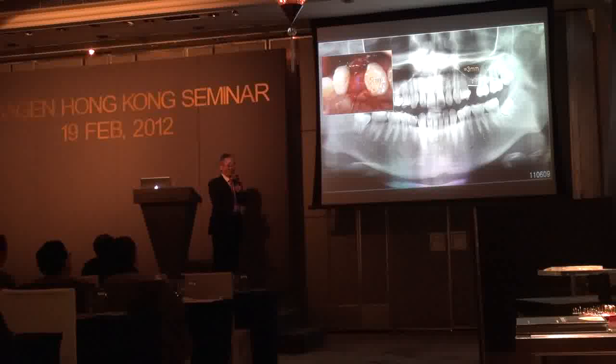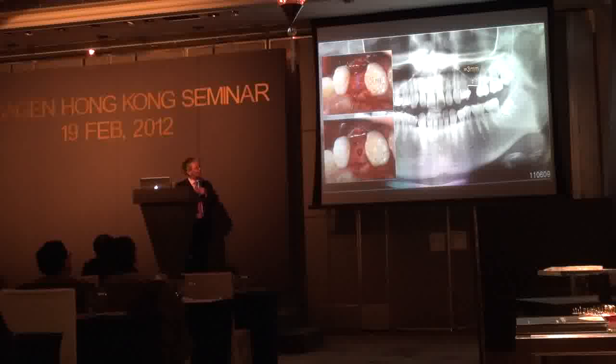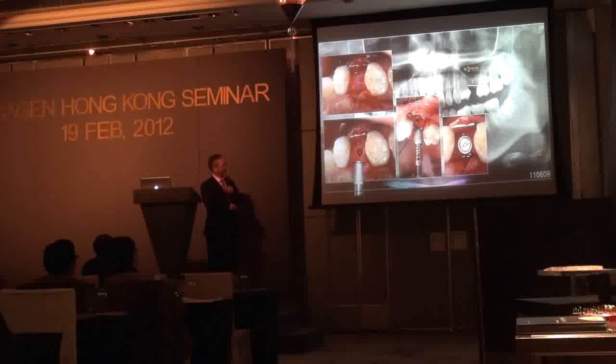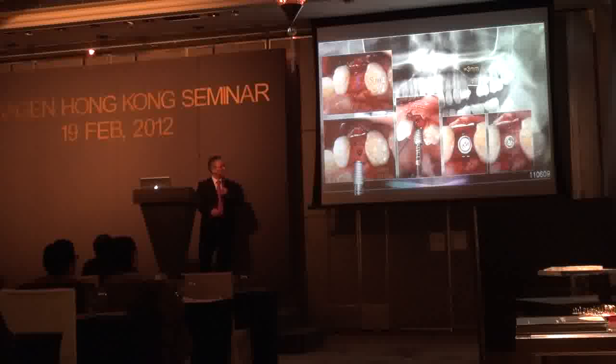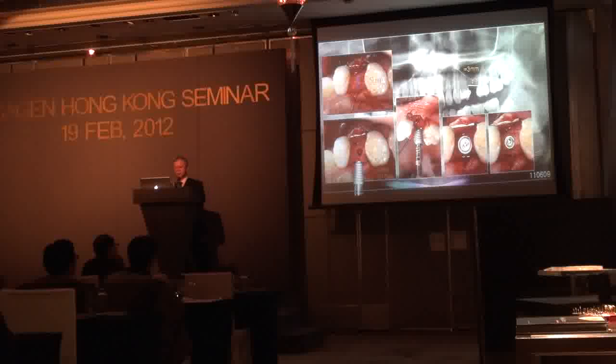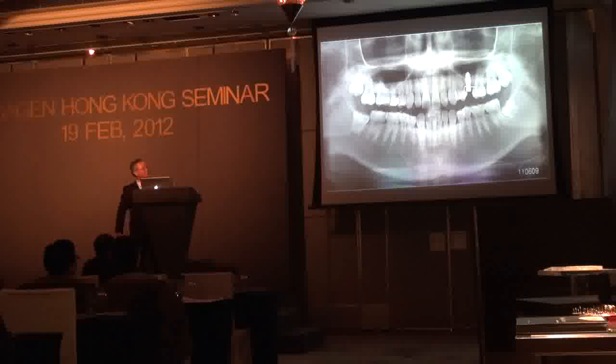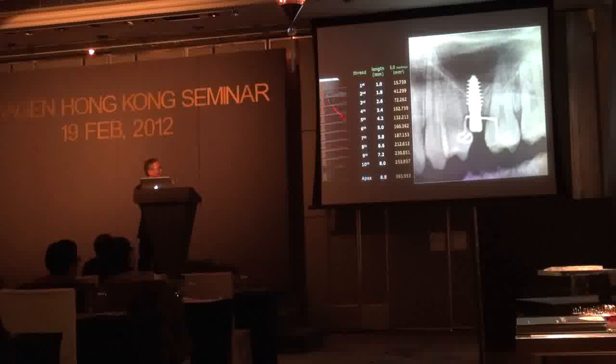So I recommended placing it through a small hole, and I placed the 5 millimeter wide diameter implant. During placement, yes, exactly, this is 5 millimeter, so you can see the width of the ridge, exactly 5 millimeter. And then when I placed it, it went down. Only 3.3 millimeter of the core was exposed, and I placed this much bone concomitantly and connected healing abutments. At the surgery, it looks like this.